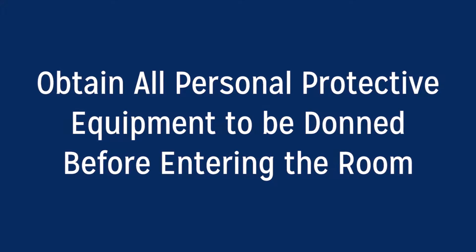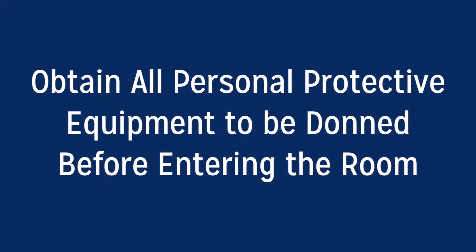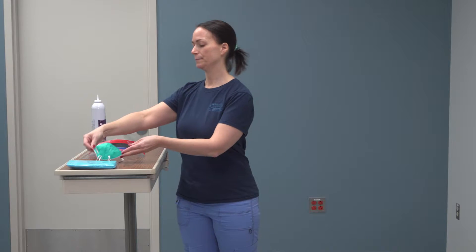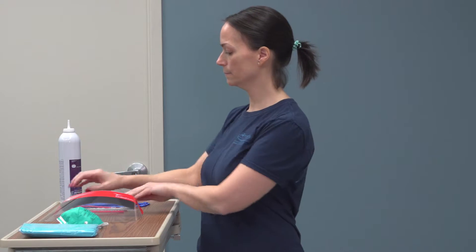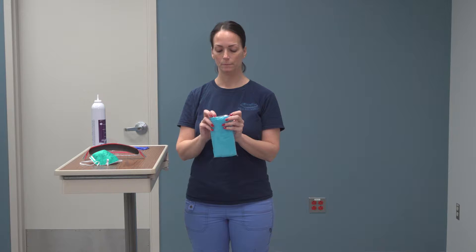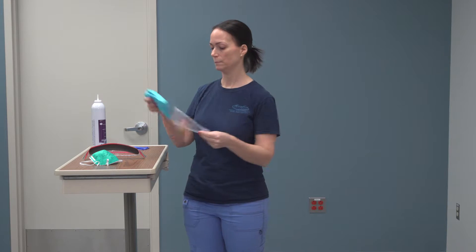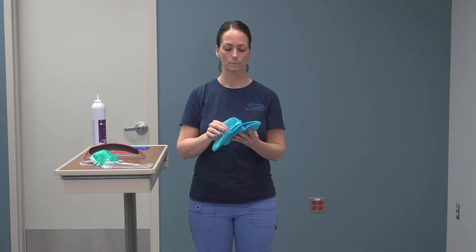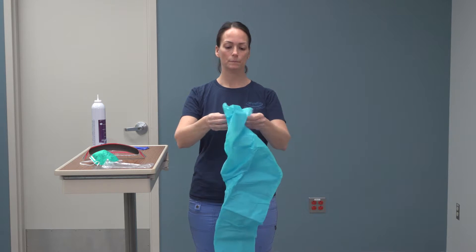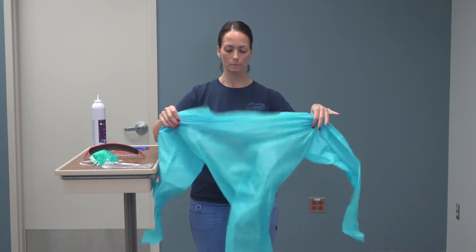Prior to entering room, obtain all personal protective equipment to be donned outside of room. Materials needed include N95 mask, goggles or eye protection, blue isolation gown, and gloves.